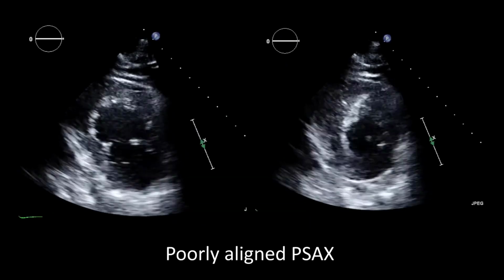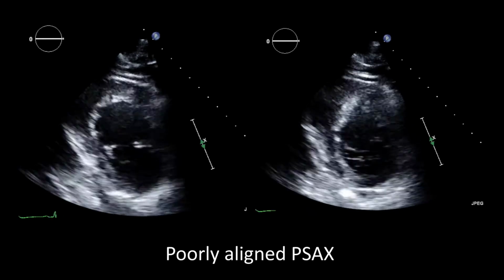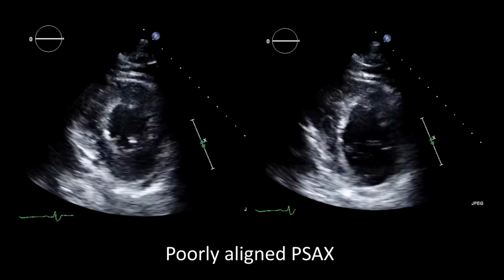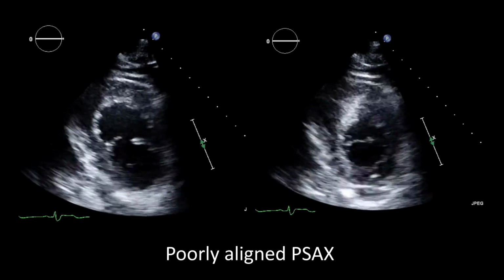These are poorly aligned parasternal short axis views. You can see that both cavities are oblong rather than round. The mitral valve is showing in both and no papillary muscles are seen. This is both closer to the base and also cut at an angle.